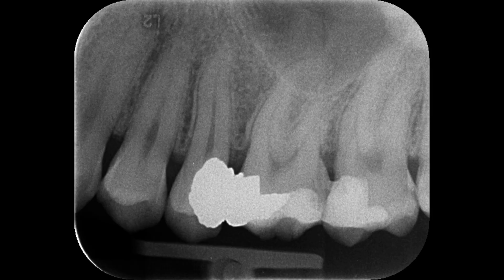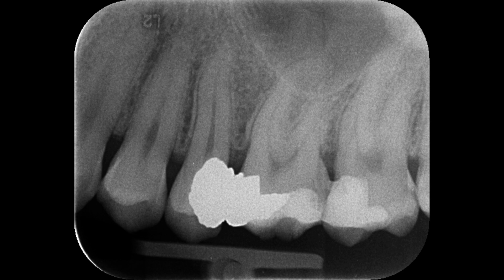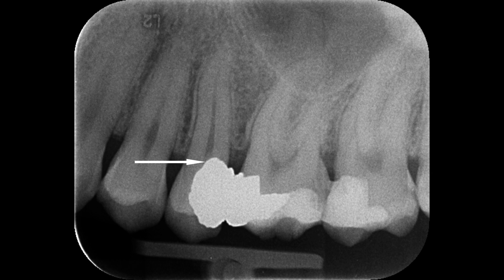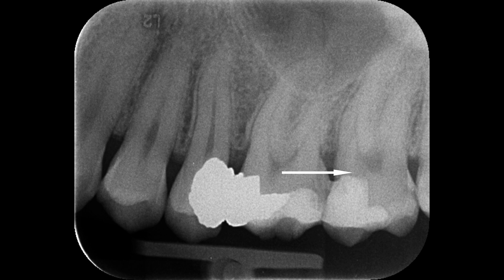First, have a look at this case — there are three restorations. There is a glass ionomer restoration in the maxillary second molar tooth and two amalgam restorations, both of which are faulty. This is the preoperative radiograph, where you can see that the restoration on the second premolar is very close to the pulp, and the glass ionomer restoration on the maxillary second molar is also very close to the pulp.